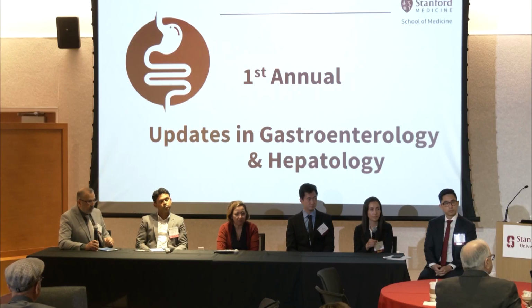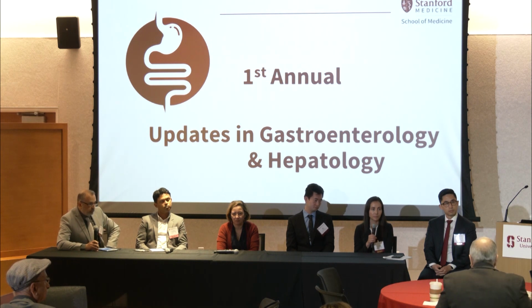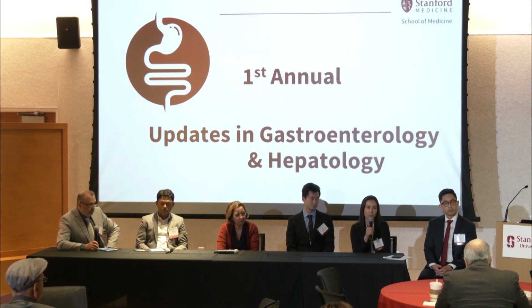Do you think dumping or any downstream issues are things we'll have to worry about like 5 to 10 years down the road? I think less so with G-POEM, just because you don't distort the anatomy so dramatically, and so I don't think you're going to see that. And even anecdotally here, we haven't been seeing that too dramatically. I think technically with pyloroplasty, maybe a little bit more because you distort the anatomy much more dramatically.